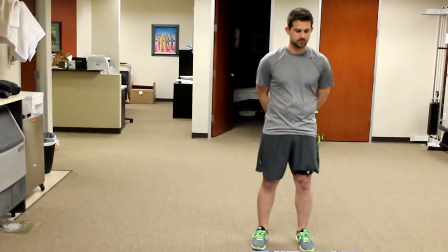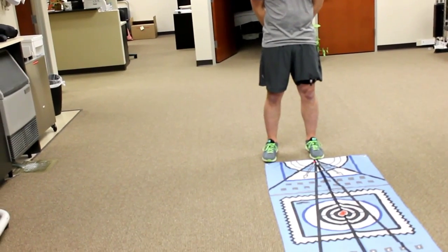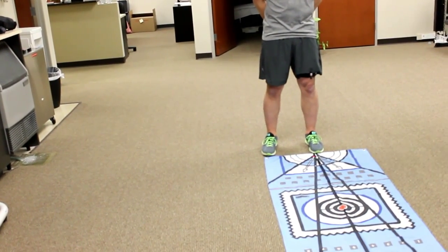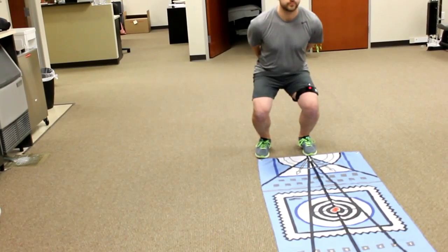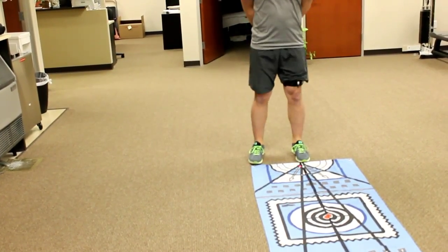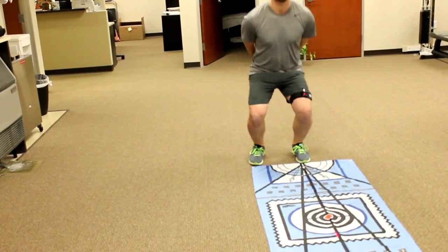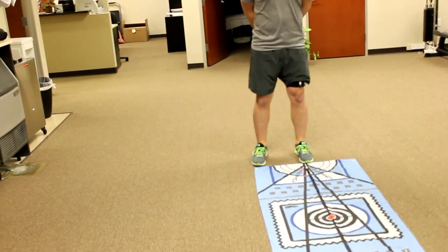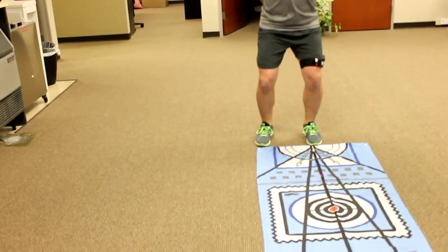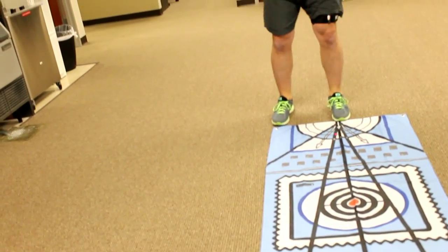We want him to look forward and not down at the laser. So just give me your best squat there Chris, maybe do five squats. While he's doing that I can look at sagittal plane motion as well as watch the laser to see if I'm getting any frontal plane deviations that I might want to assess as either faulty or maybe contributing to his dysfunction.